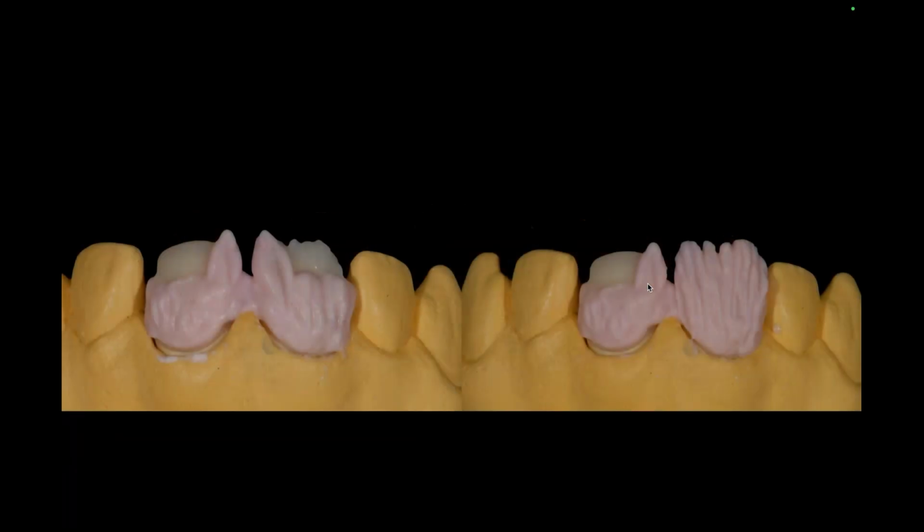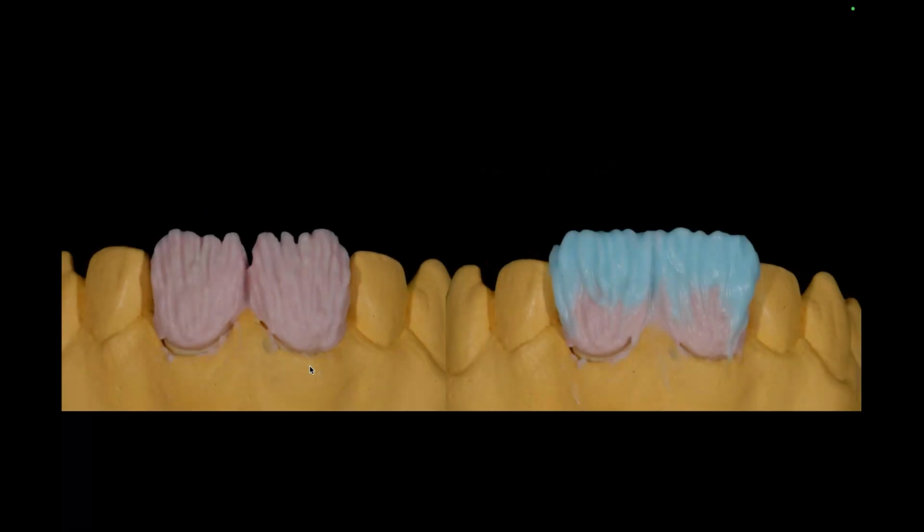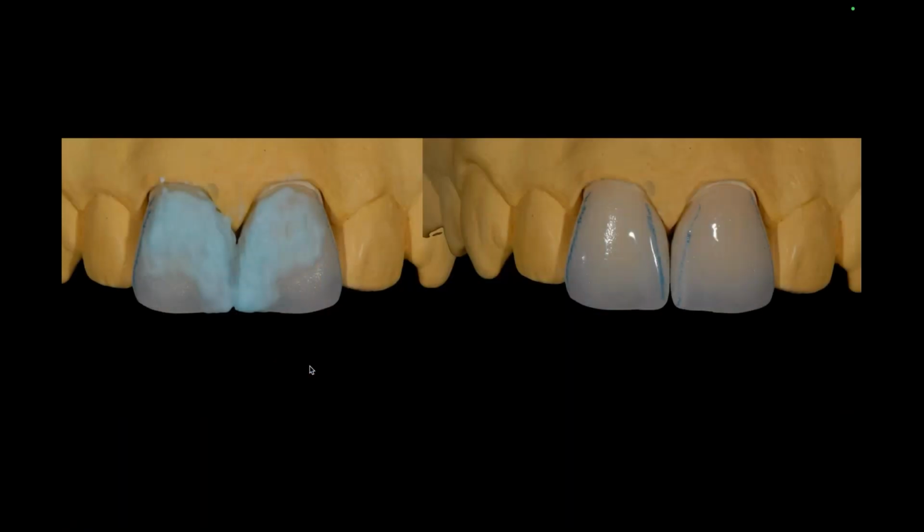Now what I'm going to do is I'm going to come back and I'm going to build both crowns with 1 dentin. That's just a straight A1 dentin. So realize this has no opacious dentin materials behind it. This has 4 of them behind it. I'll build up my dentin, just A1. I'll use 1 enamel, in this case ENL or 57 or whatever you use. And I'll fire the crowns and come up with a little correction bake and I'm done.